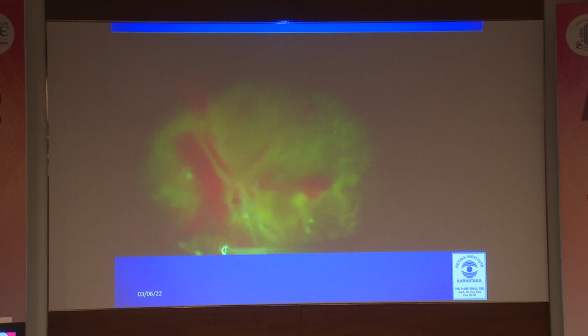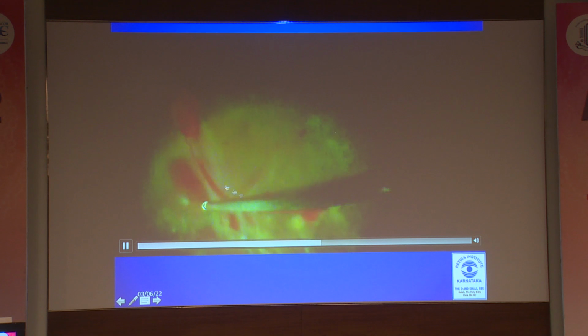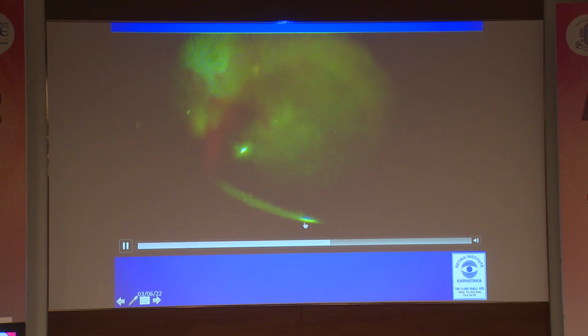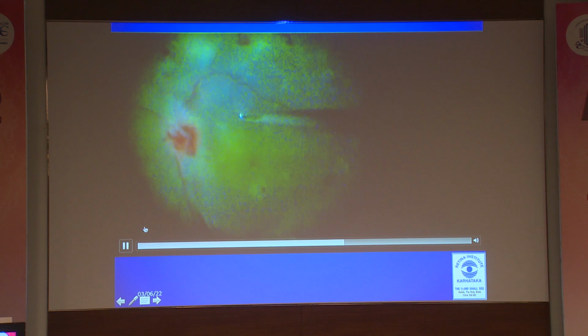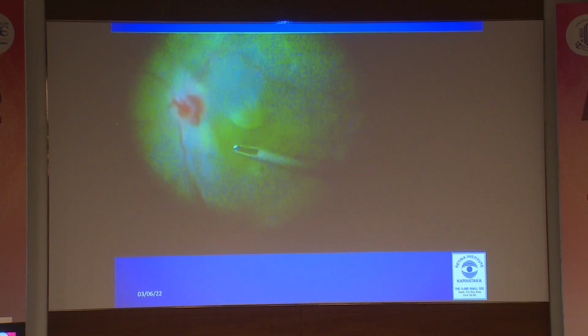And once we have removed all the membranes using the cutter itself, we achieve hemostasis, and this is what I was telling you: you can cause a break by pulling on the clot. So this is something that you should avoid. Having said that, I did create a break because of this maneuver.